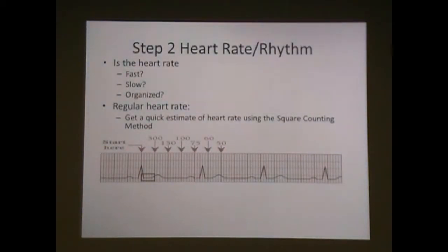When I used to go into MRI, where we couldn't take a lot of machines, I worked off a pleth. I got a pulse ox, and I could tell a lot about their heart rate based on that. If it's sinus, not sinus, if I'm skipping beats, if I have PVCs, you can tell a lot.